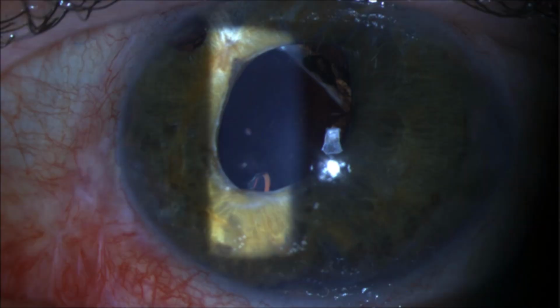Finally, here you can appreciate the appearance of the tube in the sulcus at postoperative month 1. The tube is positioned bevel down, aligned at the level of the pupil, and remains completely covered by the sclera.